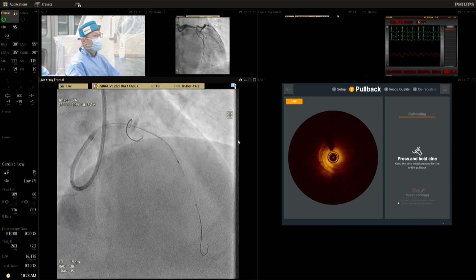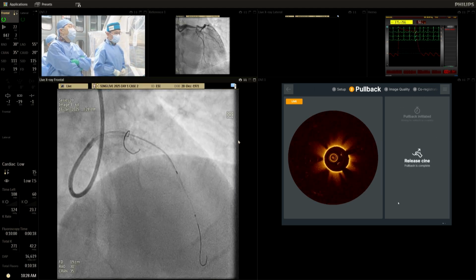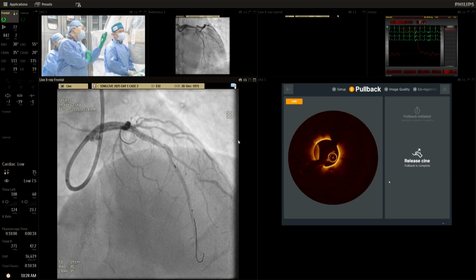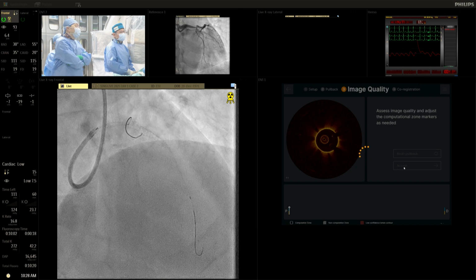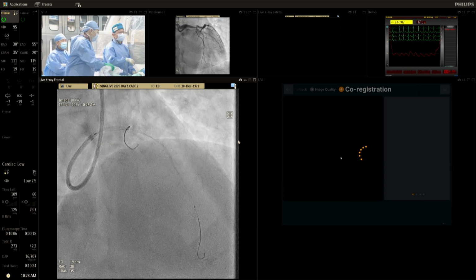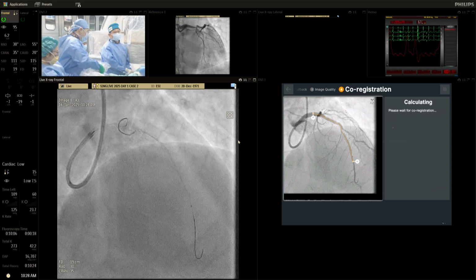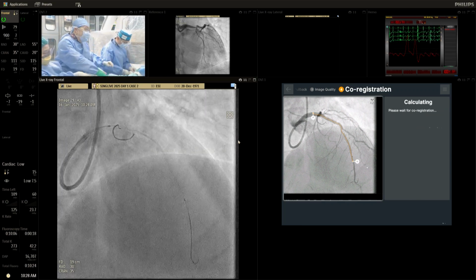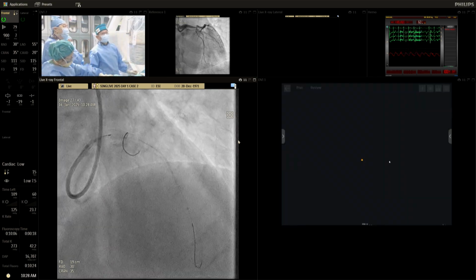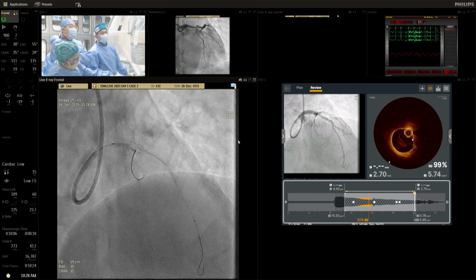So we're doing the post dilatation OCT. The flow in the circ looks good. Not sure whether the ostium is compromised, but not in caudal view. So would anyone just leave it like this if the ostium is not compromised, or would people routinely do KISS for the circ? It's a small circ anyway.